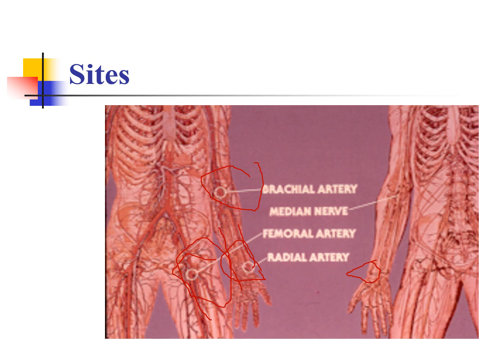So if you lay down flat and you feel with your pinky finger your iliac crest, so you feel that bone in your hip, where your first finger hits, or your pointer finger, should be roughly in that sort of crease of the leg. You should be able to feel the femoral artery in that site.